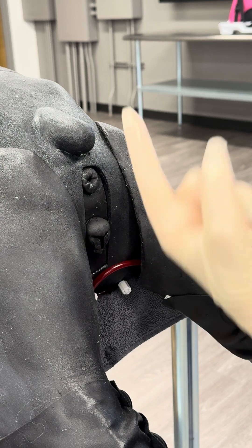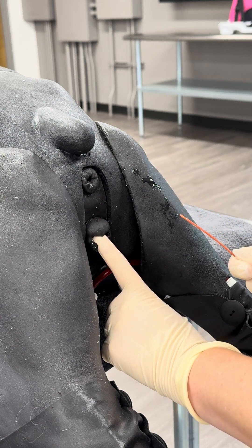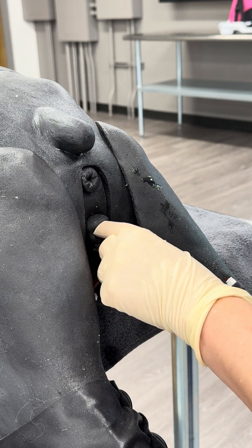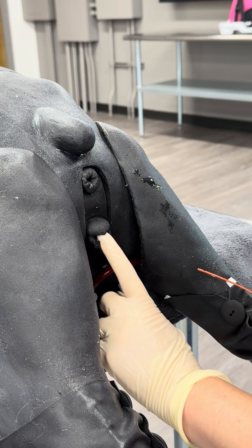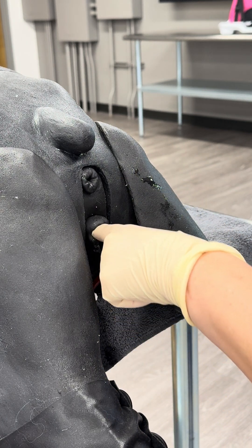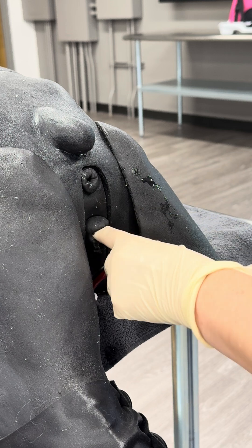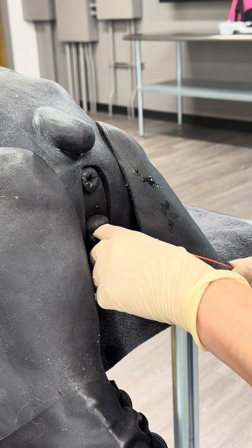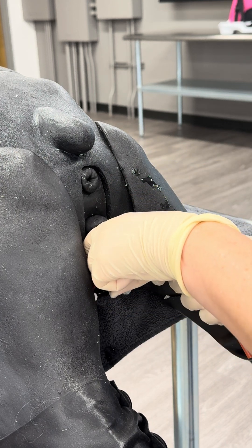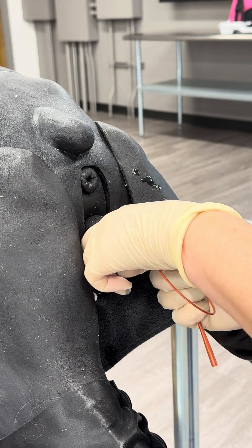With my sterile glove, I'm going to take my non-dominant finger and go inside of the vulva. I'm going to angle my finger a little bit dorsal to make sure I get completely inside of the vaginal vestibule. In a real patient, I'll have to make sort of this angle before then straightening my finger out. I'm occluding the cervix and uterus with my non-dominant finger, lifting the vulva up, and then I'm going to glide the catheter along the ventral aspect of my finger and the ventral aspect of this dog's vaginal vestibule.